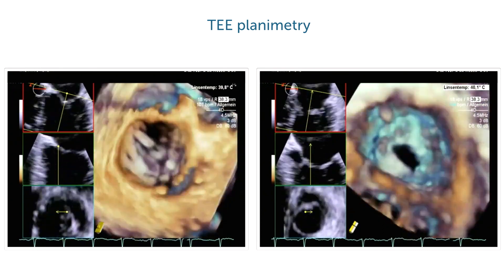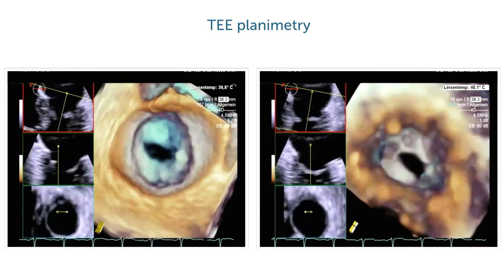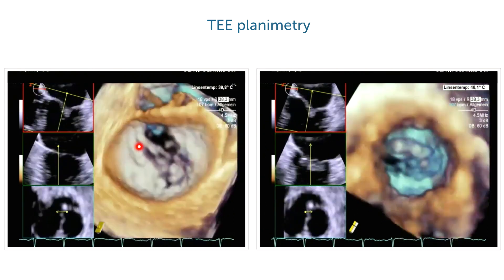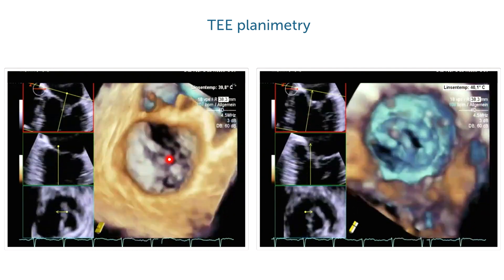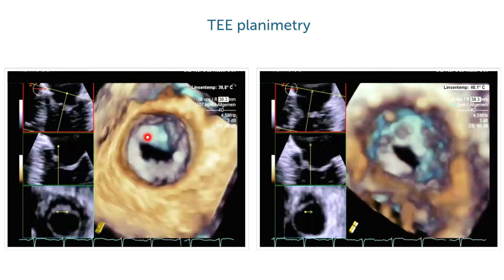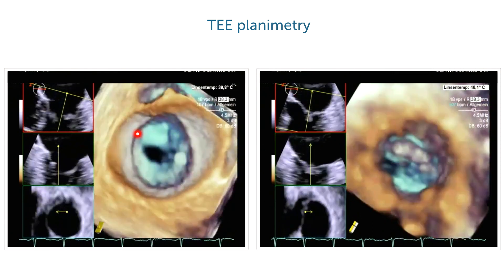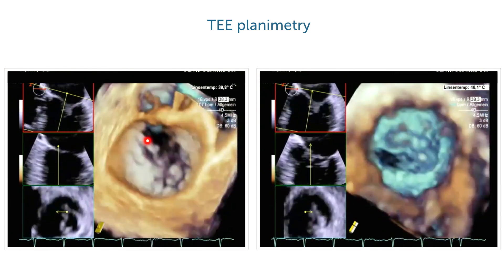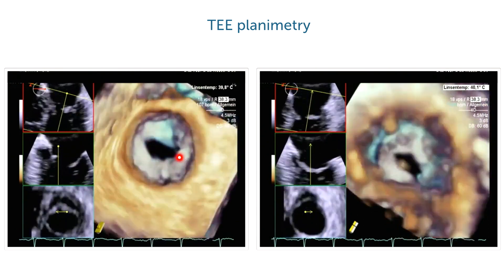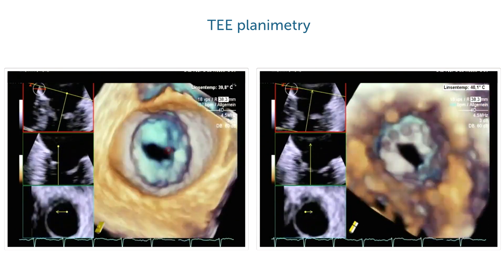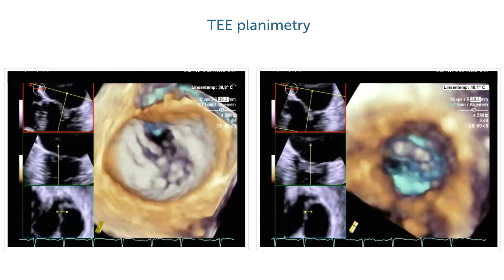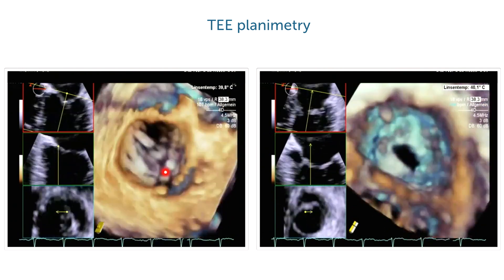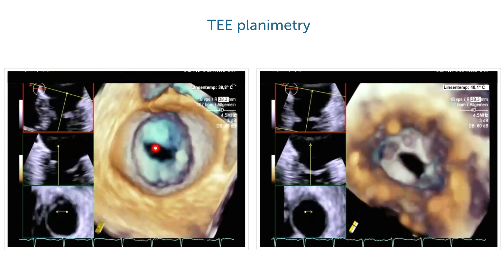This is the view of the mitral valve as seen from the left atrium. You can see the orifice right here. Notice that the shape of the orifice is rounder than normal because we have commissural fusion. It is also nice to perform a visual assessment of the size, and to use special software which allows us to calculate the orifice area.